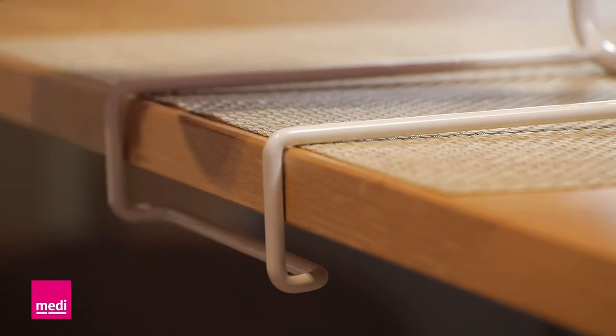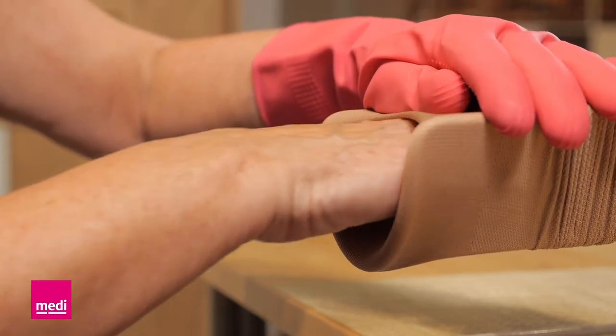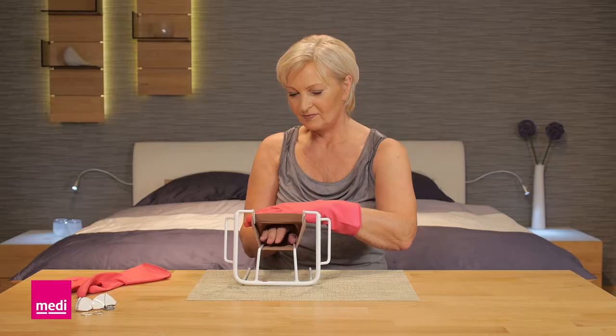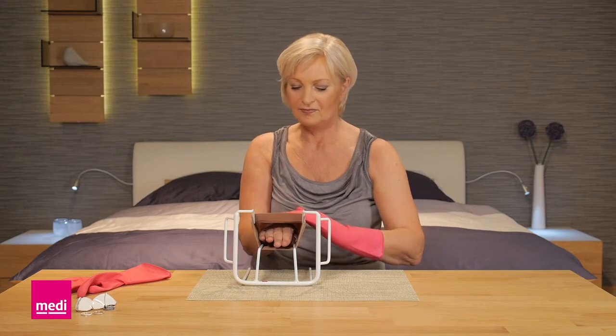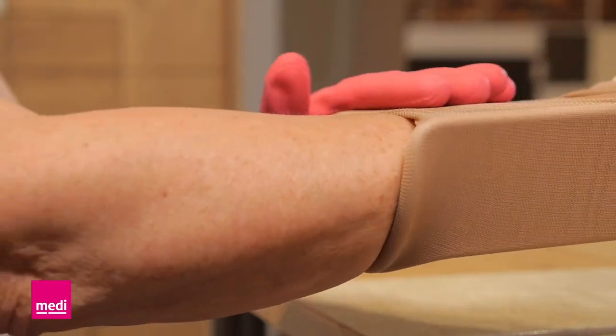Now lay the butler down and stabilize it by hooking the bracket over the edge of the table or the work surface. Push your hand into the arm sleeve with the back of your hand facing upwards. Hold the butler steady with the other hand.